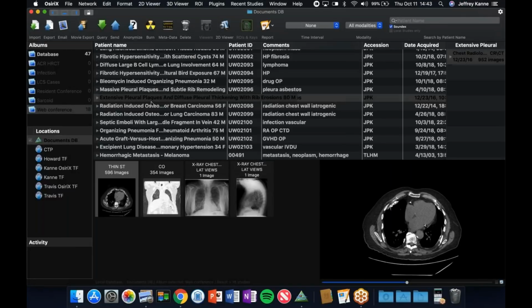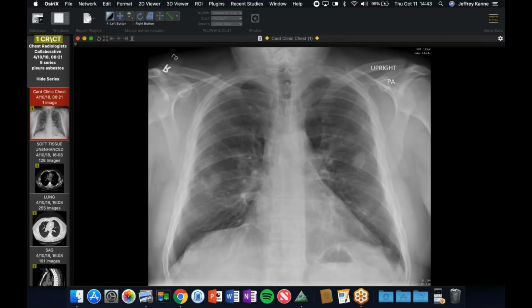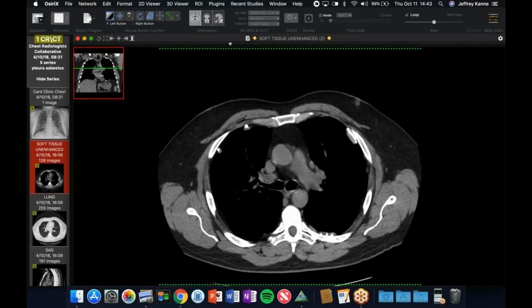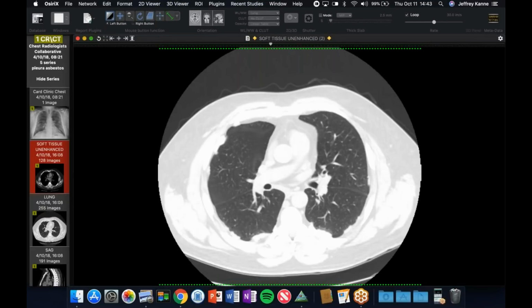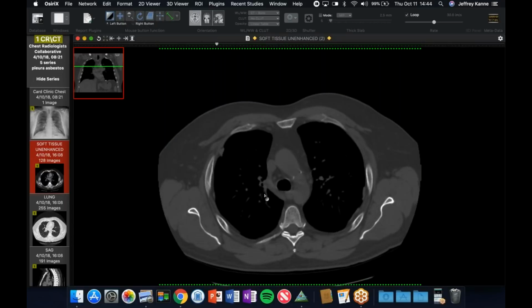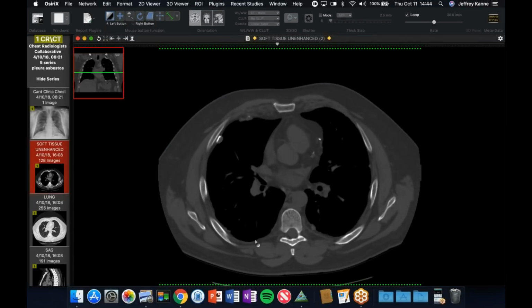Now, as luck would have it, I was scoring a bunch of cases as part of an epidemiologic project from Libby, Montana. And this is another patient who was exposed to asbestos, not occupationally, but environmentally. And also, let me get the right window here, has these exuberant plaques. Now, you notice there's no pleural thickening in this case. There's extrapleural fat, but some of these plaques are quite large.